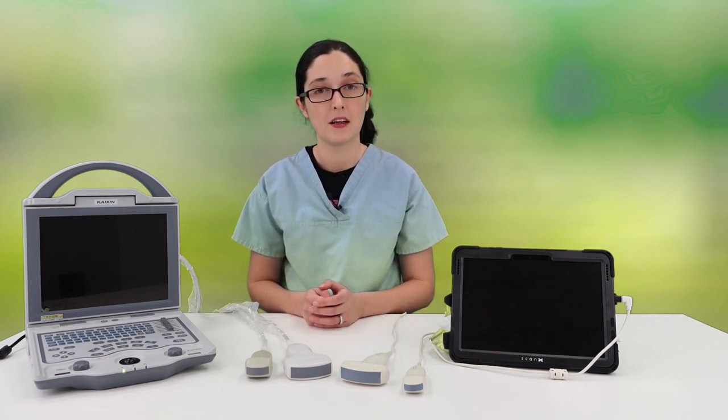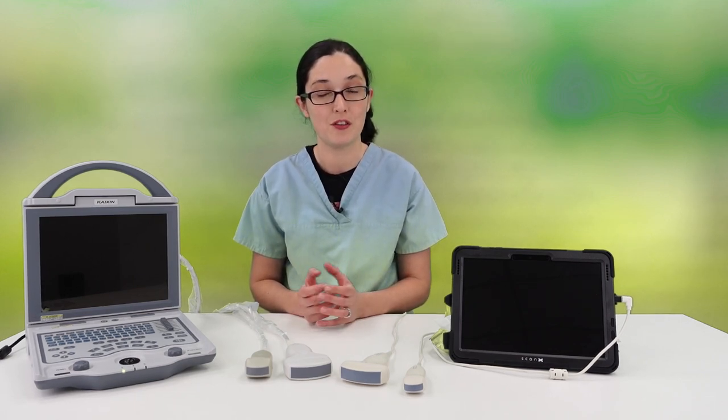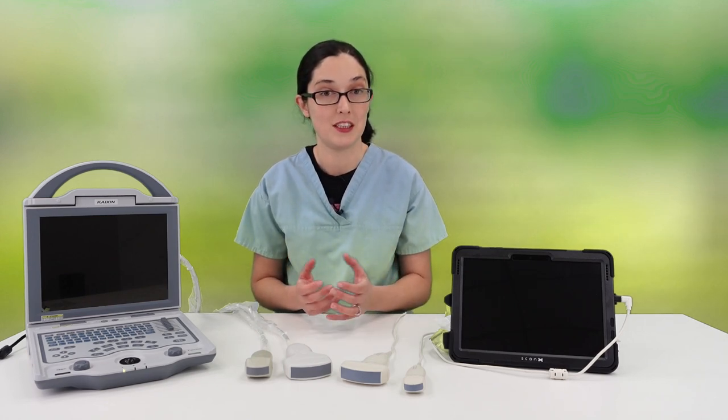What that means for us when we scan goats is that for our smaller breeds like Nigerian Dwarfs or Pygmy goats, we can afford to use those higher frequencies and get really beautiful images. But for larger goats, we're going to have to drop our frequency in order to get the penetration that we need.